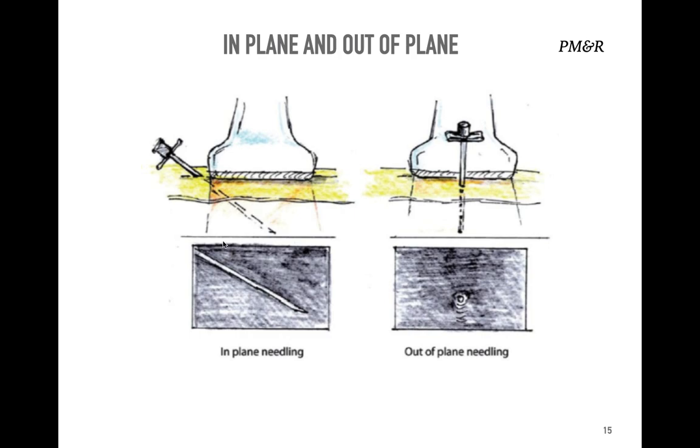This is another image showing in plane and out of plane. Out of plane takes less time when compared to in plane.